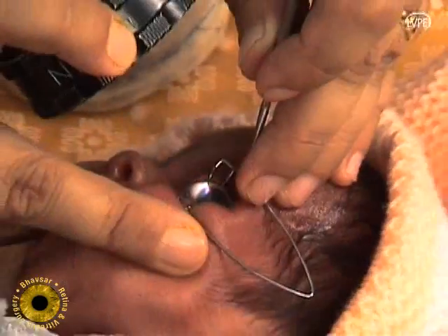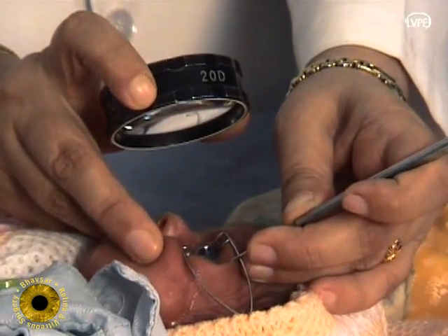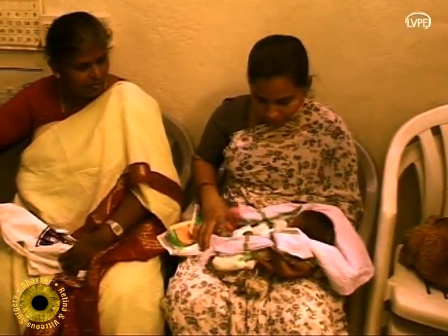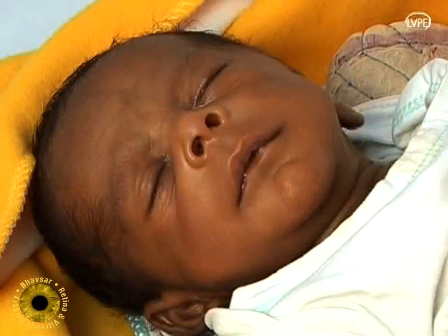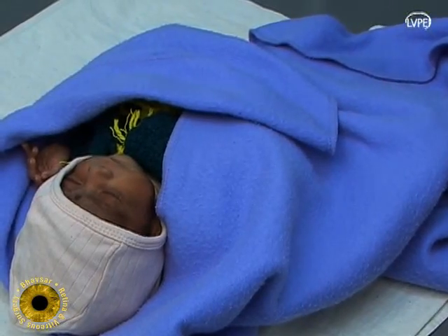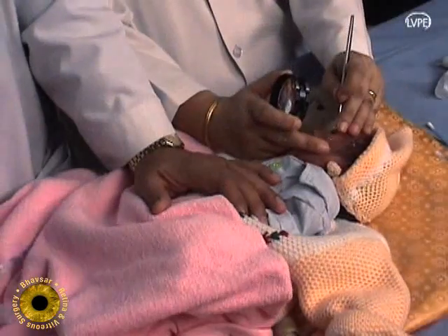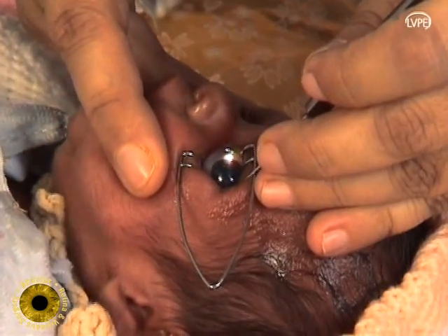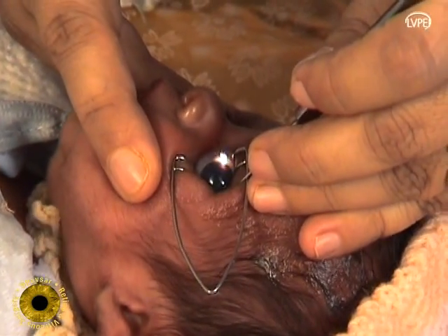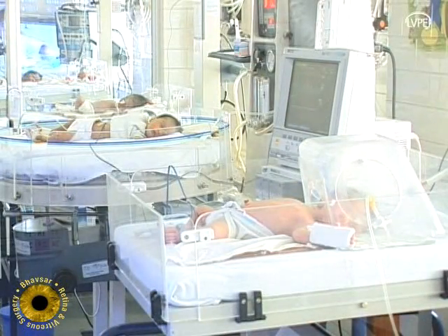Laser treatment for retinopathy of prematurity (ROP) can be done successfully under topical anaesthesia provided we pay attention to the details. Thirty minutes before starting the laser, the baby is fed and burped to avoid hypoglycemia or vomiting. The child is wrapped well to avoid hypothermia. Laser is performed in a warm room equipped with resuscitation equipment and personnel on standby. A pulse oximeter is attached to monitor the baby.